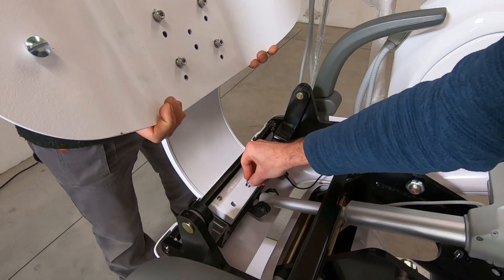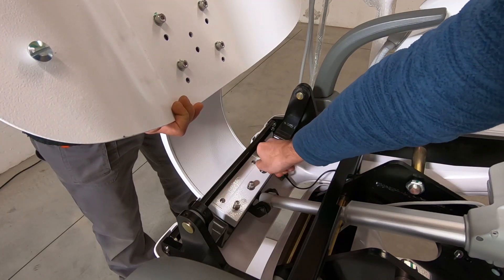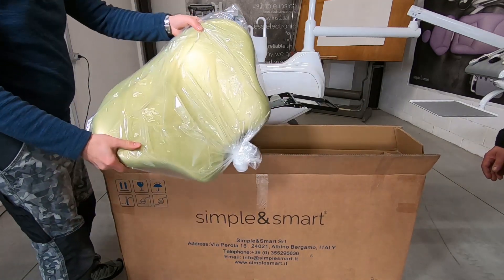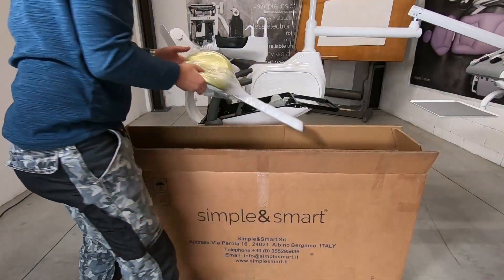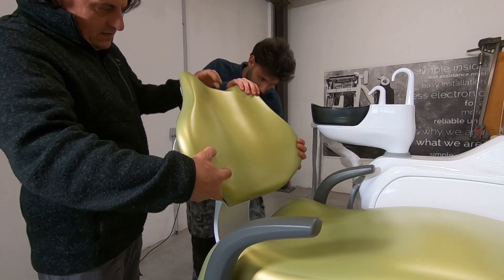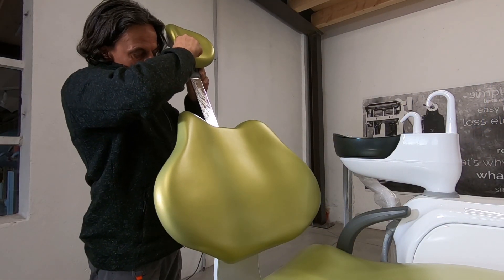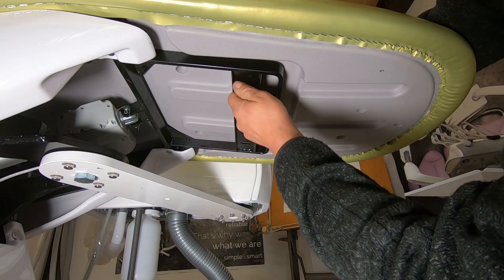Fix the backrest on the seat and place the headrest. Put the backrest on its support and place the headrest. Fix the seat by closing the two screws under the seat.